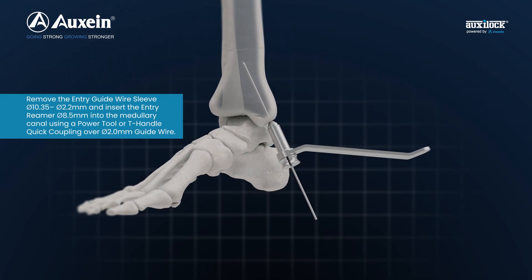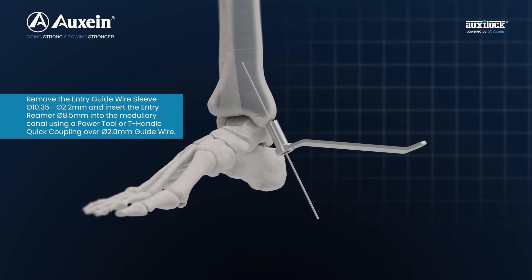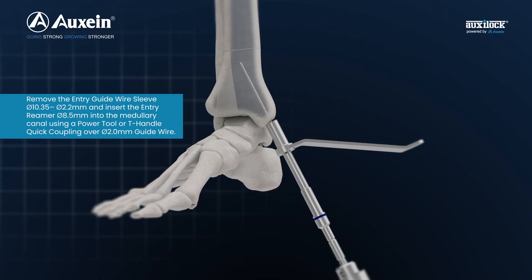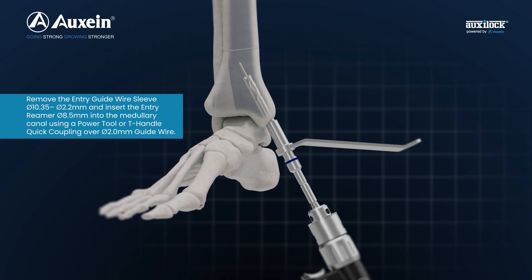Remove the entry guide wire sleeve diameter 10.35 to 2.2 mm and insert the entry reamer diameter 8.5 mm into the medullary canal using a power tool or T-handle quick coupling over diameter 2.0 guide wire.